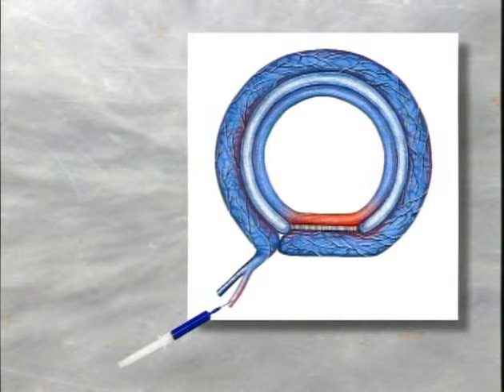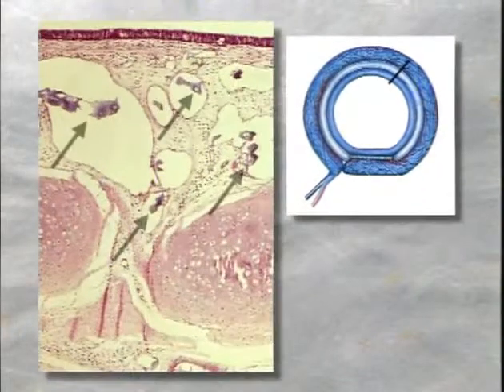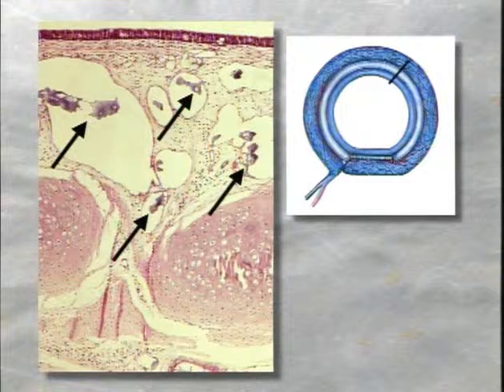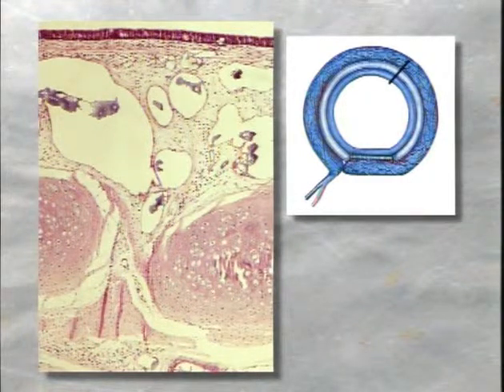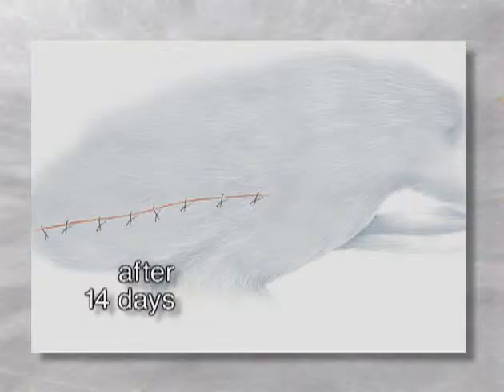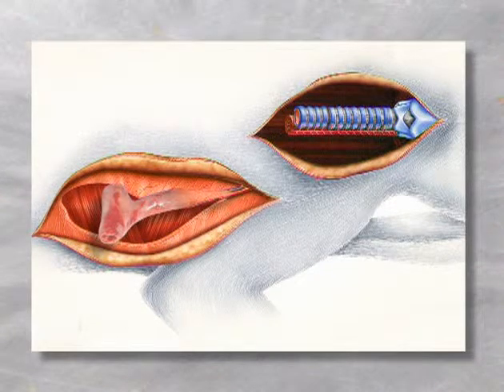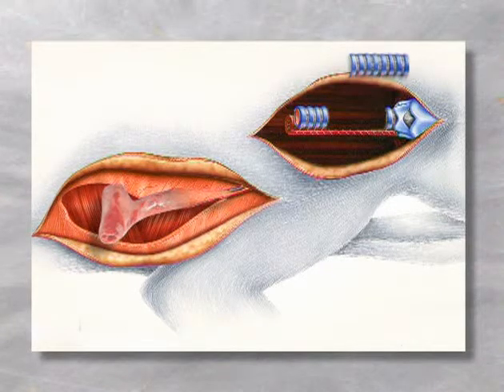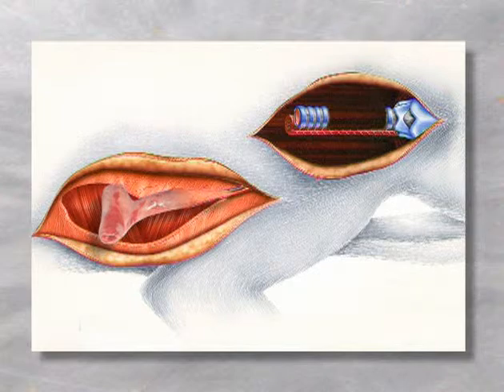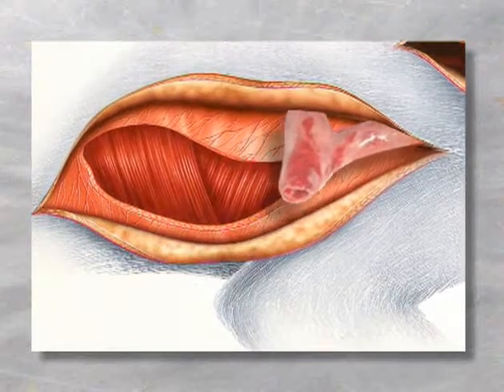A longitudinal section shows a lamina propria which is fully perfused by the fascia flap with blue silicone inside the blood vessels, and the epithelial lining has regenerated into a ciliated epithelium. The allograft is fully perfused after the 14 days revascularization period so that it can be transplanted in an orthotopic position. Therefore, a 2 cm segment of native trachea is removed and the allotransplant is transferred to the neck with preserved blood supply.